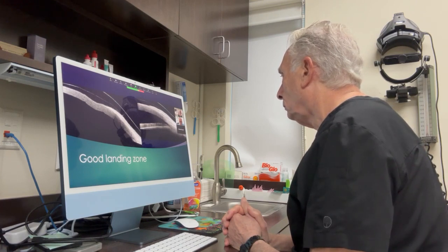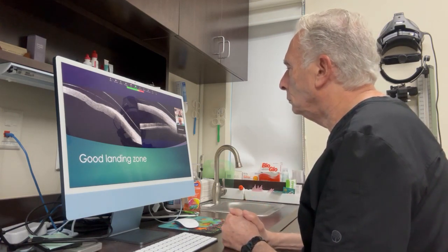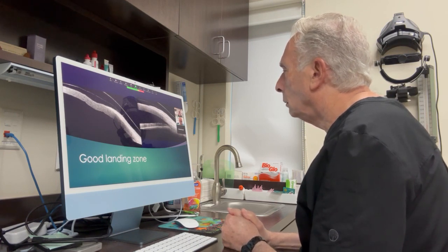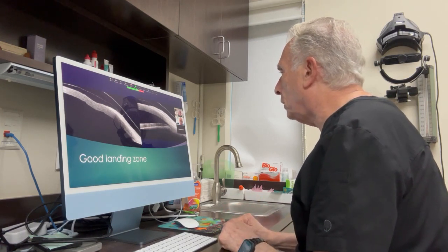Okay, another question before I try to get some questions from the audience. I have seen most of your slides are full scleral lenses, 16.5 or larger. Do you work with semi-sclerals or not? I don't use the word semi-scleral. It's either a scleral or it's not scleral. It's either a woman is pregnant or she's not pregnant.